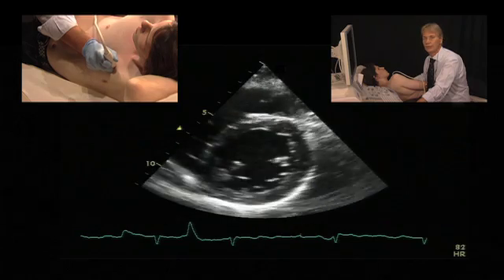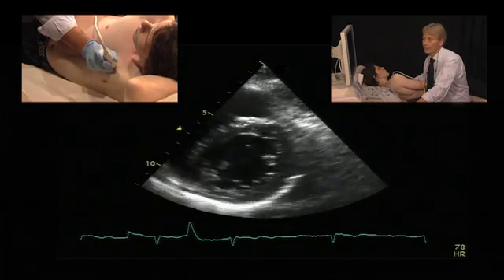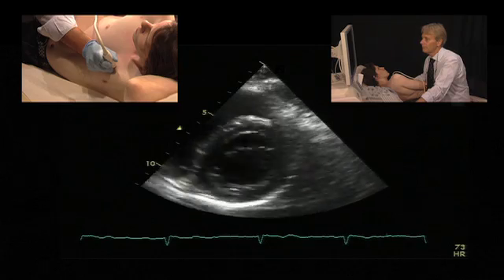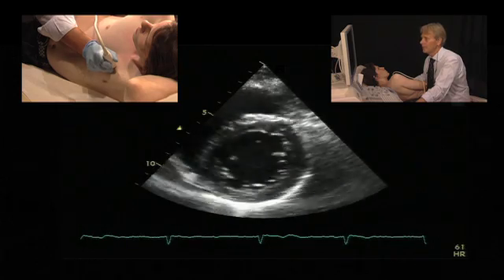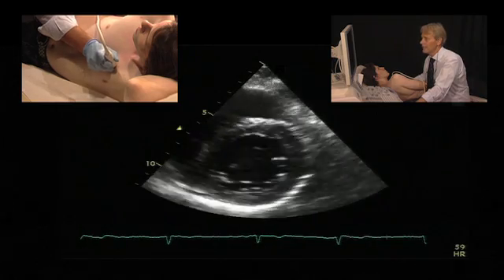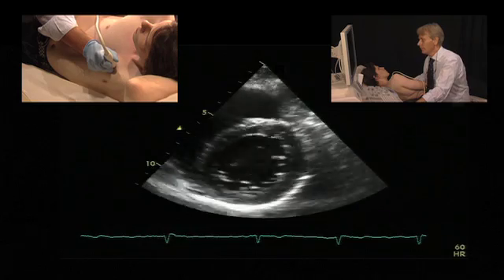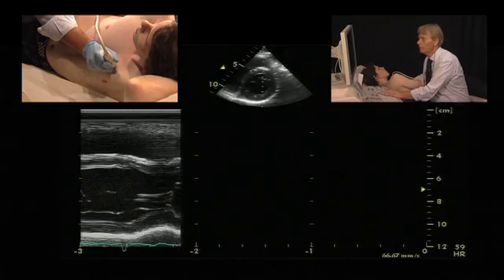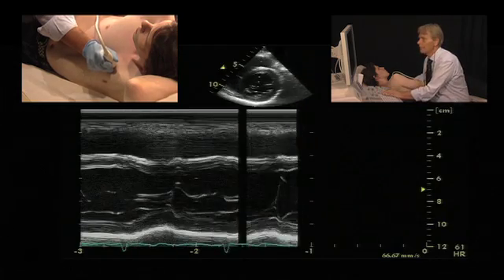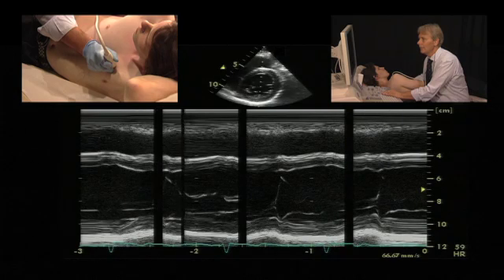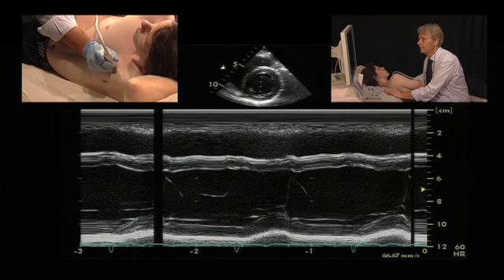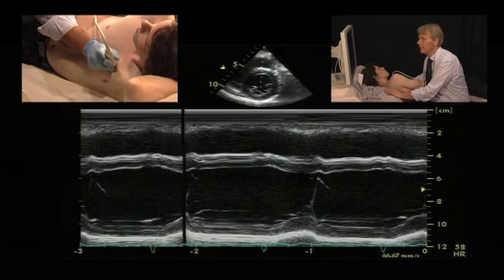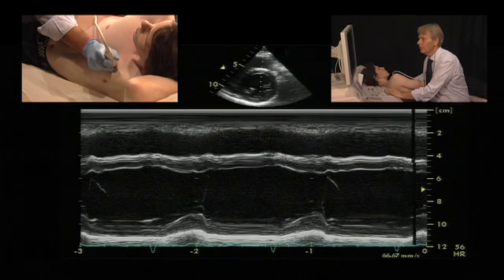The first thing you have to look into is if the ventricle is really round. This is important for the reasons already mentioned. Once you have a nice view of the left ventricle, you will put the M-mode exactly through the middle of the left ventricle, and optimize the image so that you have a very good contour.